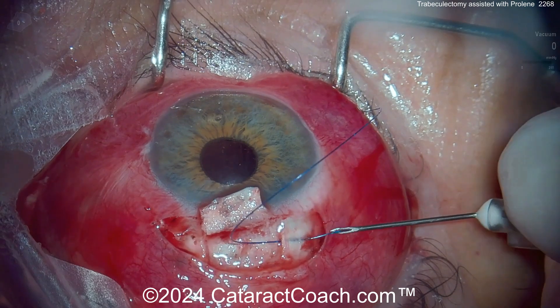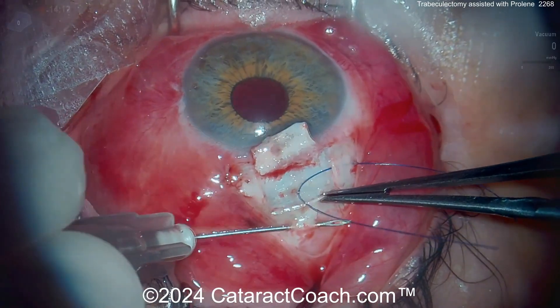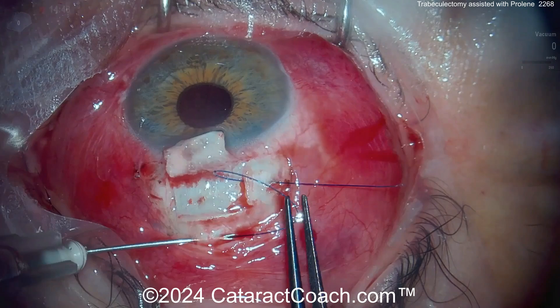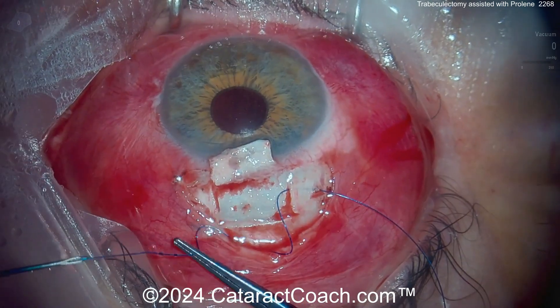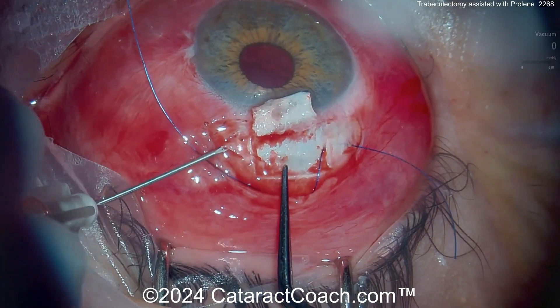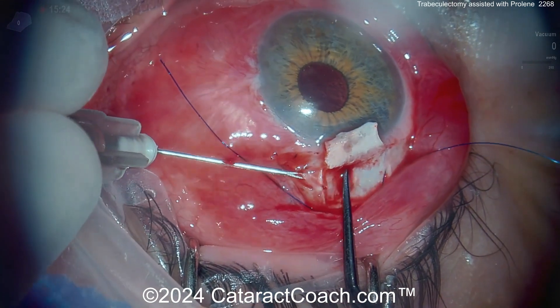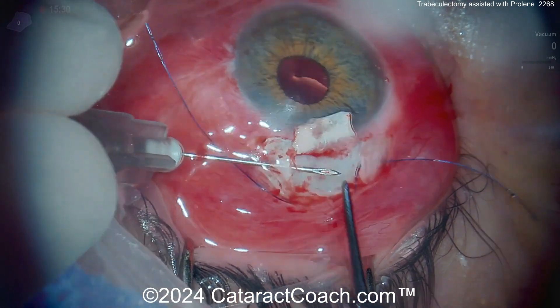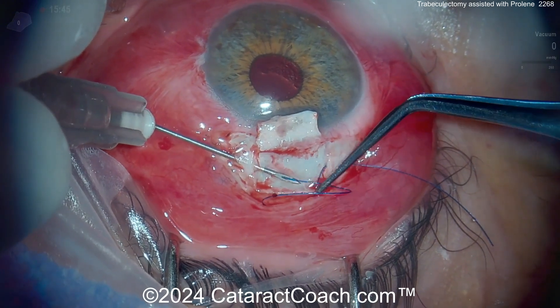Feeding in this proline suture, pulling it out the other side. And again, here's the other path at the insertion of the superior rectus — that'll go through. And finally the other side of the trabeculectomy flap. Once that's done and you feed the suture through, you'll see it lays down in a shape of kind of like an upside-down omega.